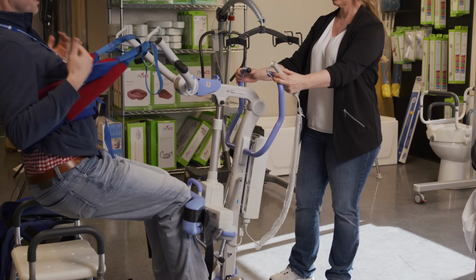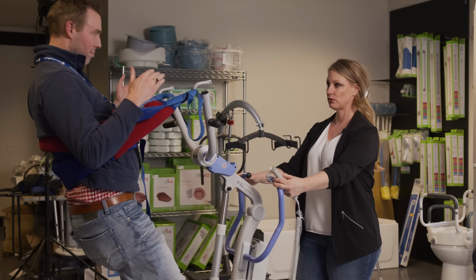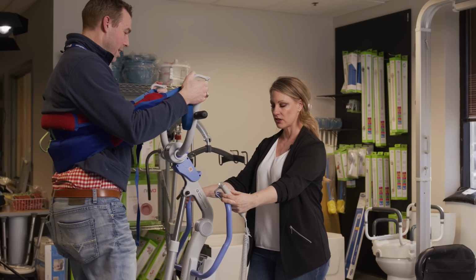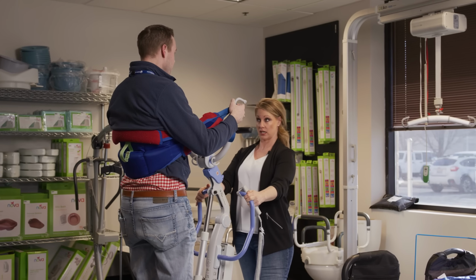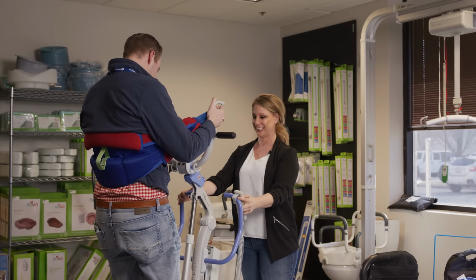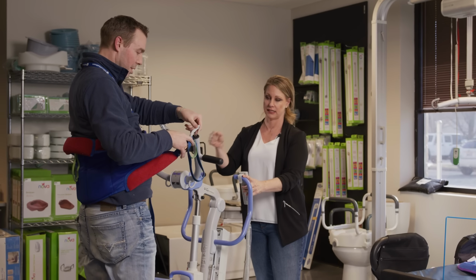And the trick with this one is that the patient has to be comfortable leaning back and able to push back a little bit, because it can bring you to a full upright position. And as long as you're not pushing on carpet or tile with grout lines, it's a pretty smooth transition, right? It is, absolutely. Super easy. Here, let me help you out a little bit. All right. This is really nice. It's really nice that it has battery and not manual.